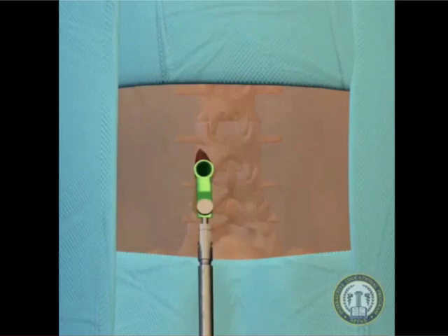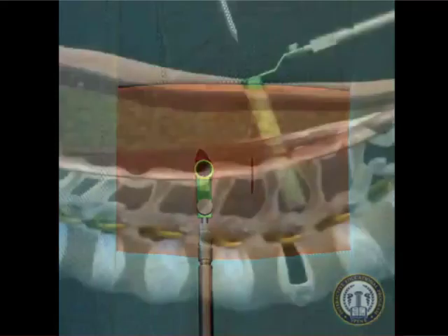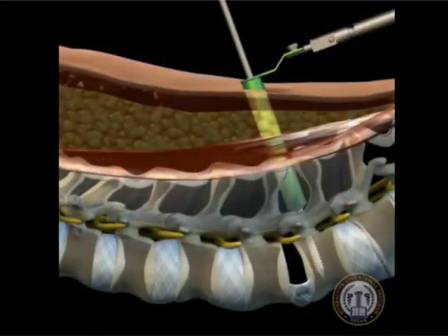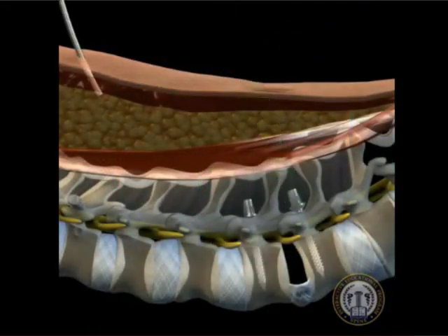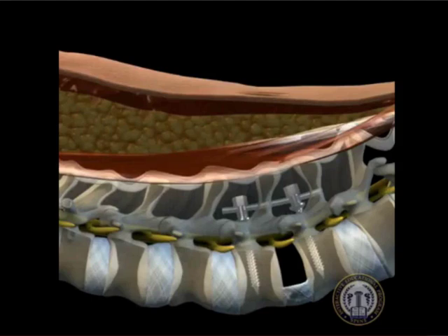Following the discectomy, the interspace may now be distracted by creating a mirror 2.5 cm skin incision on the contralateral side, centered over the interspace. Percutaneous pedicle screws are then placed, and a rod is subfascially levered into place. The contralateral screws are tightened to a distracted position in order to create optimal space for the interbody device.